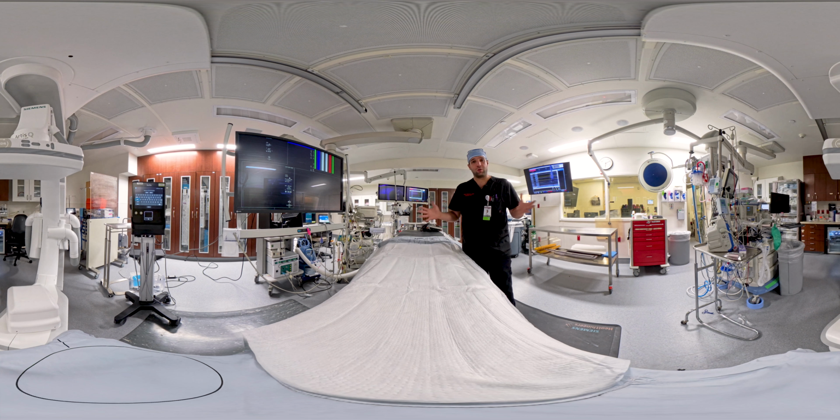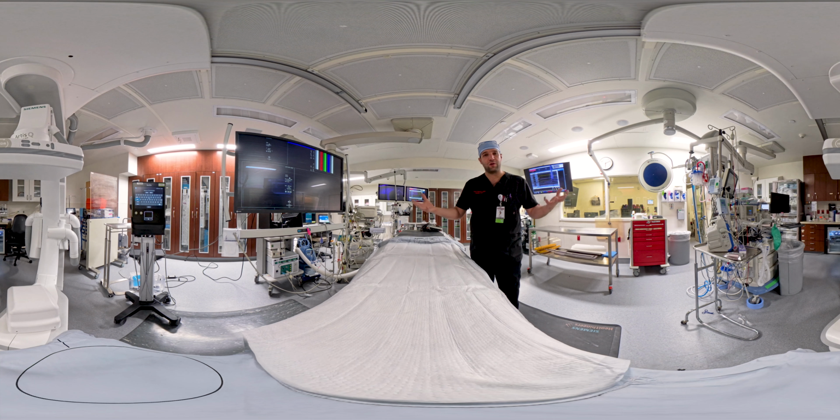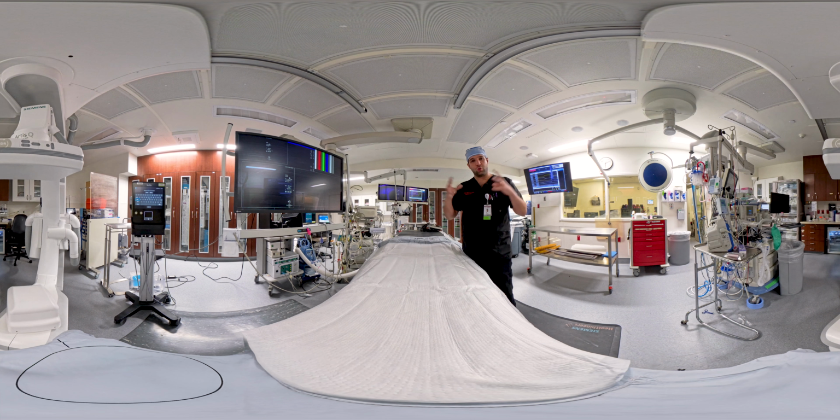After I'm done with my ablation, this is the time for me to test my work. At that point, I will pace your heart faster, or I will try to get your heart into faster rhythms to see if the ablation worked or not. If I don't see any arrhythmias happening, then we'll declare victory, and this means that the ablation that we have done is enough. But if I see other rhythms show up, then it means that I need to do more.